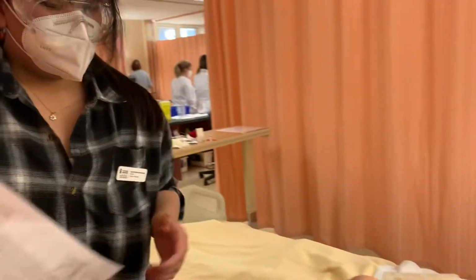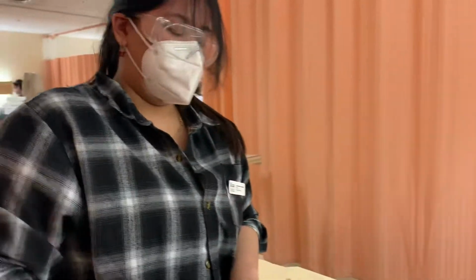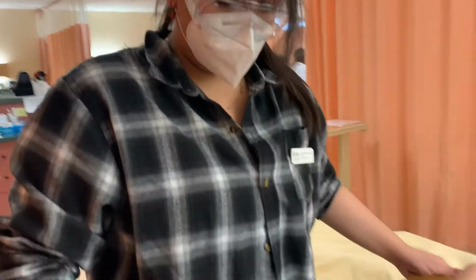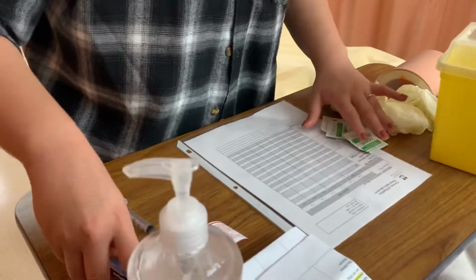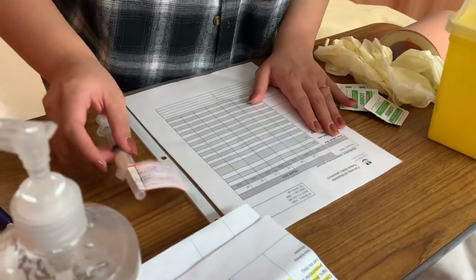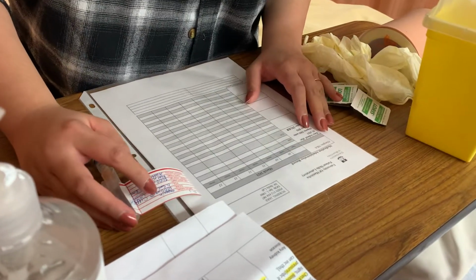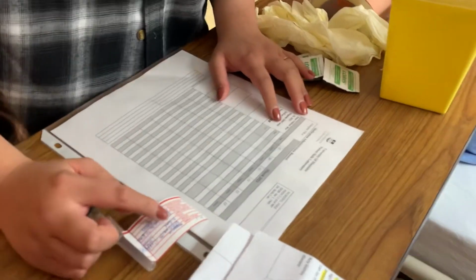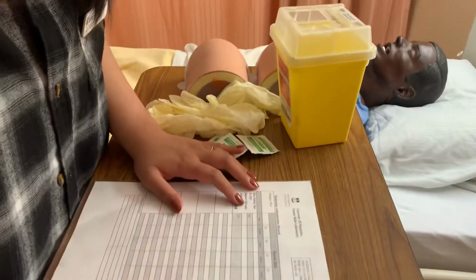So today you're going to be receiving your heparin medication, but before I give it to you, I'm going to just do my third check here by the side. Okay. So, I have my medication here. Heparin. Okay, so right patient, Nursing Jake, right medication, heparin, right dose, 5,000 units, it's 0.5 ml, and it is 0.5 ml on the syringe.